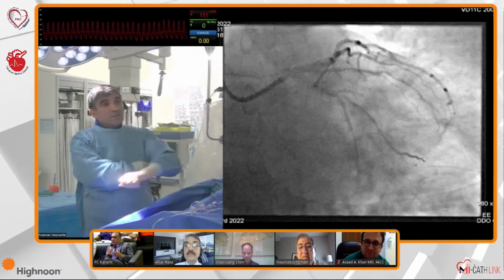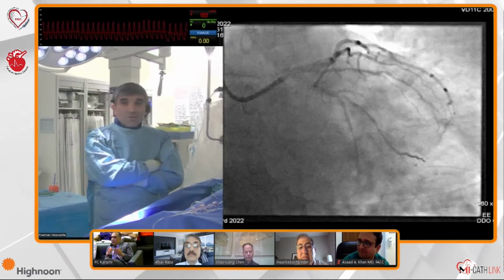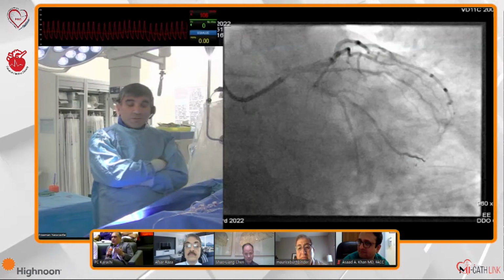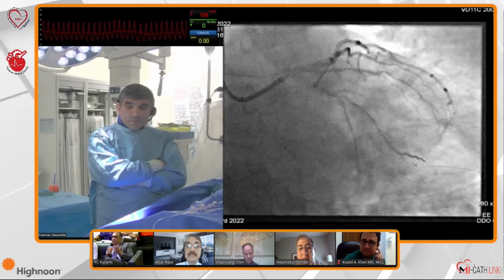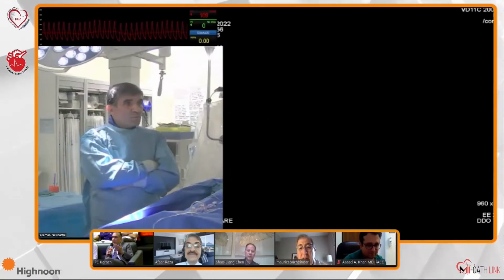And I thought, instead of showing you a definite bifurcation, the anatomy in this case is quite interesting. So if you don't mind, we could go ahead and show you the angiogram from today, and then see what the panel is saying. So if we go forward.